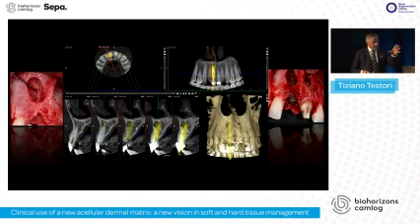We did an apicoectomy on the left central incisor, and we did an implant restoration on the other incisor.